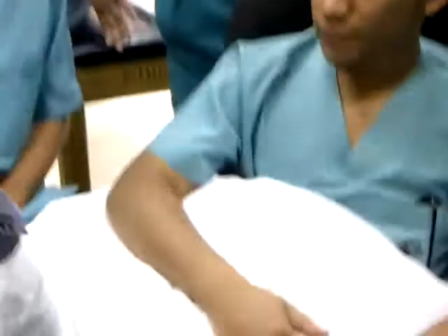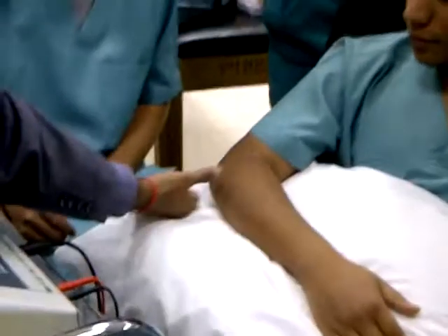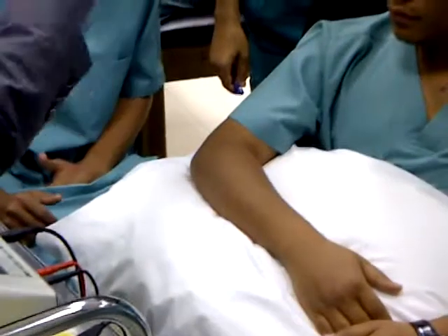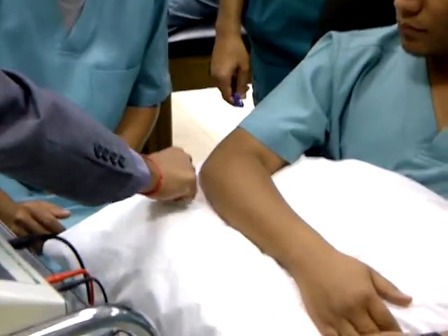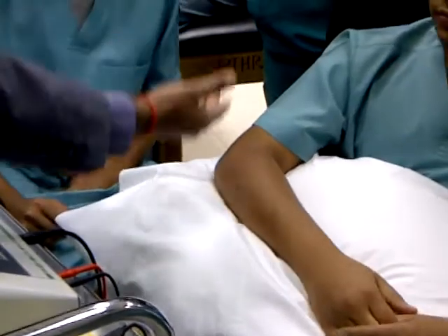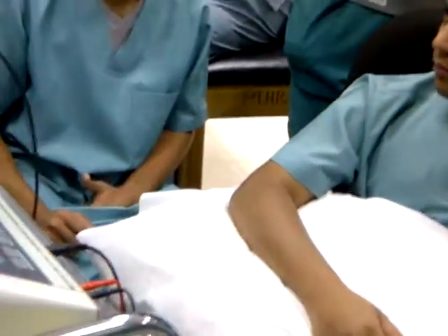Sit comfortably. And if you want, you can provide some towel down there, because whenever you are going to deal with this area, some of the gel may come down and it will spoil the pillow. Yeah, you can have some towel.